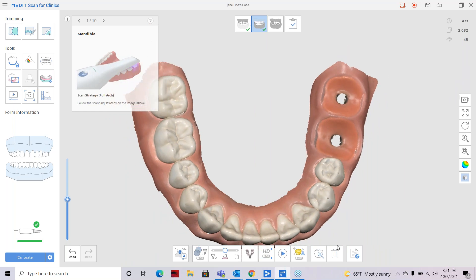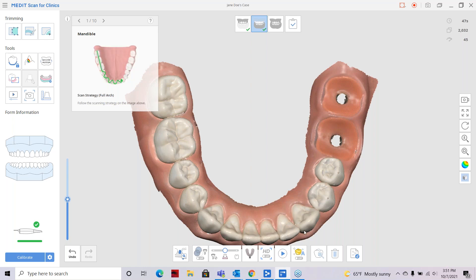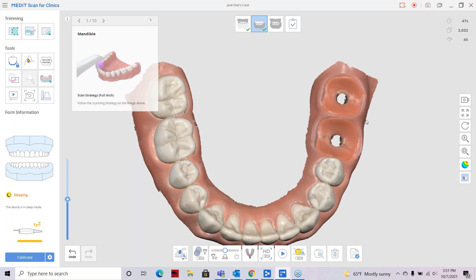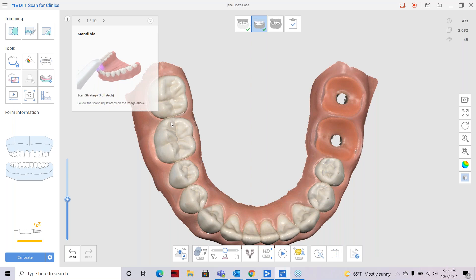I'm going to delete this file and show you how smart stitching works. With basic scan path: come forward on the occlusal surface, zigzag across that incisal edge — it's really important to establish that incisal edge prior to scanning the labial or lingual surface — then come back on the occlusal, out on the buccal, rotate over to the lingual on the way back, and come over the buccal. As you saw, that was one continuous movement.